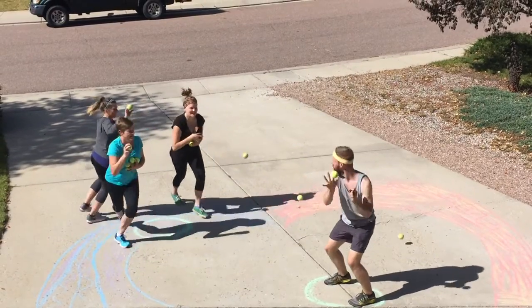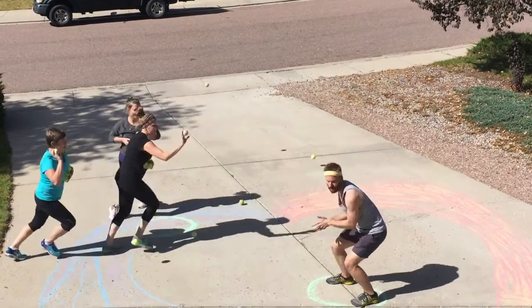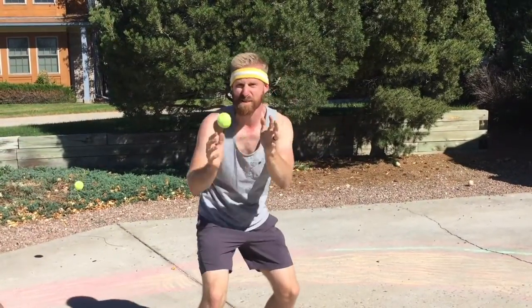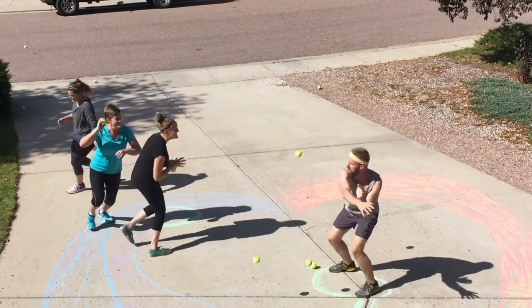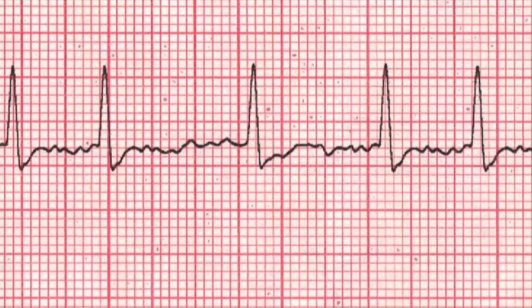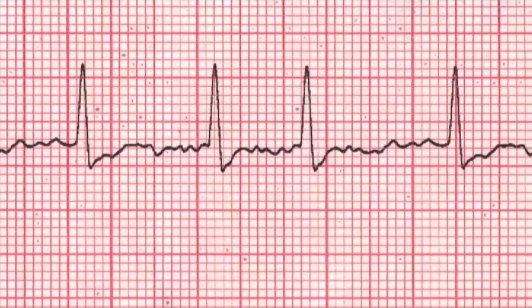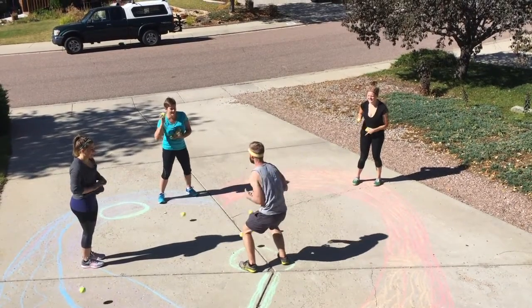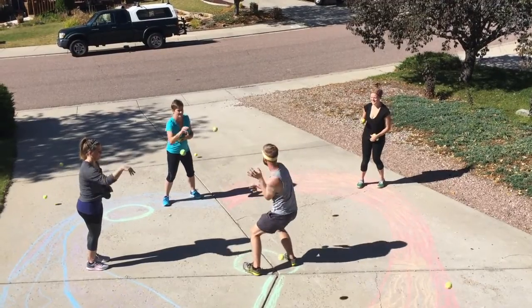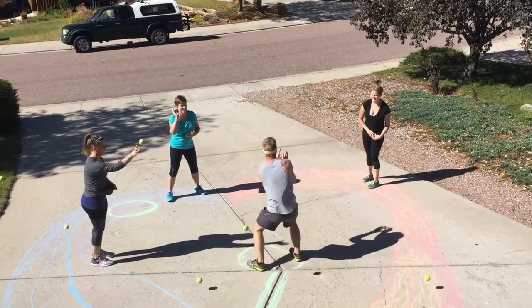AFib is crazy. It's like A flutter, except instead of the AV node taking electricity from just one point, it takes them from all points, and it takes them randomly. It's in no predictable order. It's irregularly irregular. So you can see some P waves, and sometimes you can't, and the AV node's randomly taking impulses, and some of them are hitting them in the face, and others are going down the Purkinje fibers.